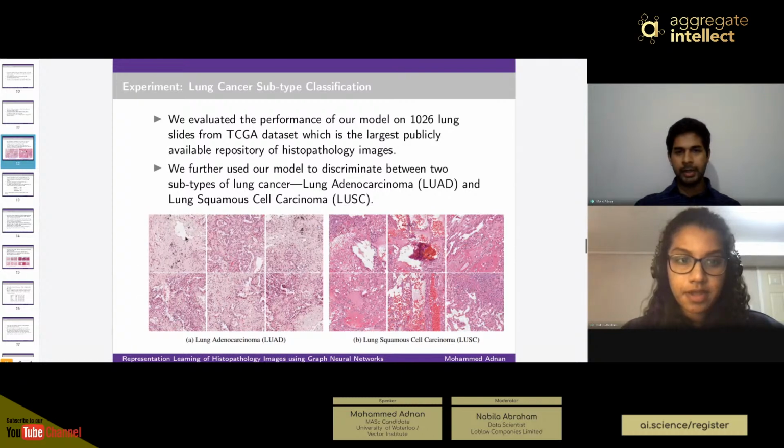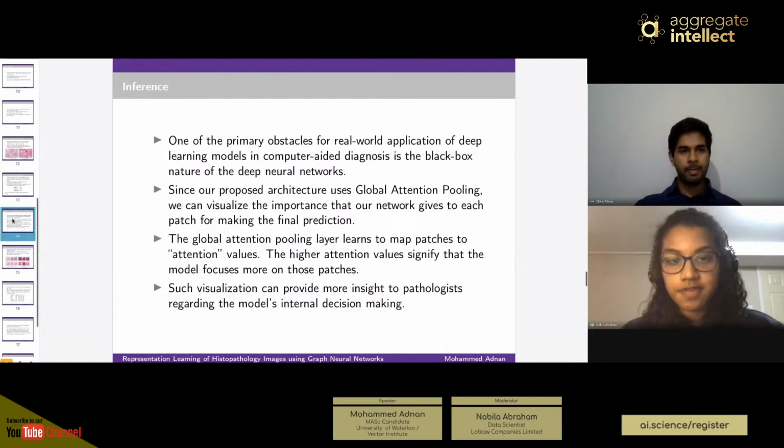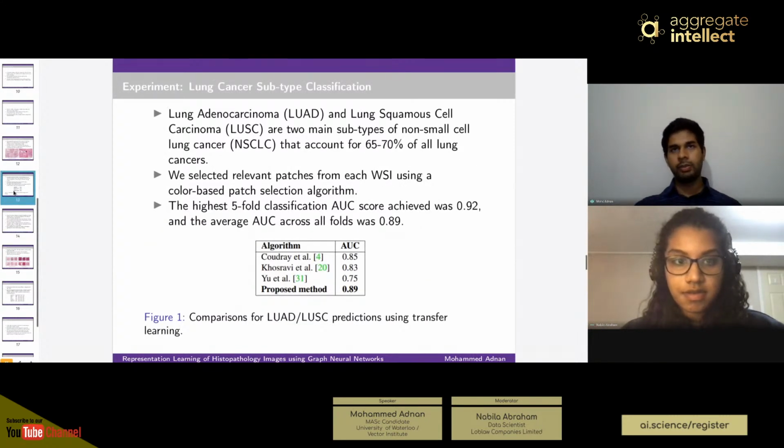So we extracted multiple patches from a single WSI, and for the entire group of these patches, we had a single label. That's what MIL needs. MIL, multi-instance learning, needs a label for the entire group of patches instead of single instances. Okay, so in a bag, you would have some negatives as well. Yes, some of the patches could be just fat tissue or something like this, which is not really useful. Okay, got it. Thank you.